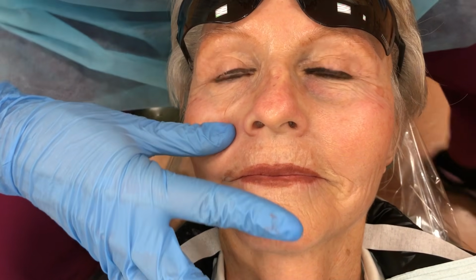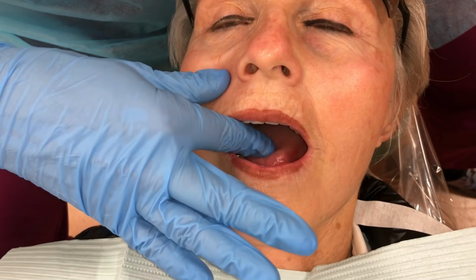It is helpful to ask the patient when they identify a sensation. You can take your thumb, cover the foramen, and then retract with your index finger. This will allow you visibility for the penetration site.